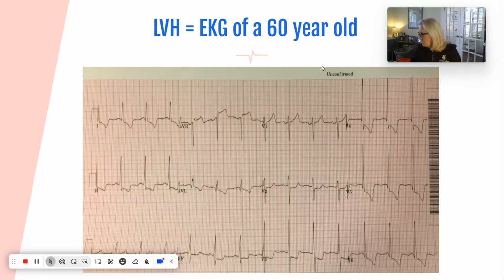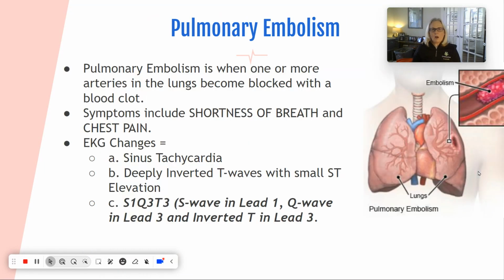And then for the 60-year-old, you also have that picture on here. I would circle the big QRS with ST depression. Okay, big QRS near the left ventricle, so V3 through 6. Left ventricle is down towards that apex, right? Circle the big QRS, LVH, and ST depression. We know this is an older person. All right, on to the next one.